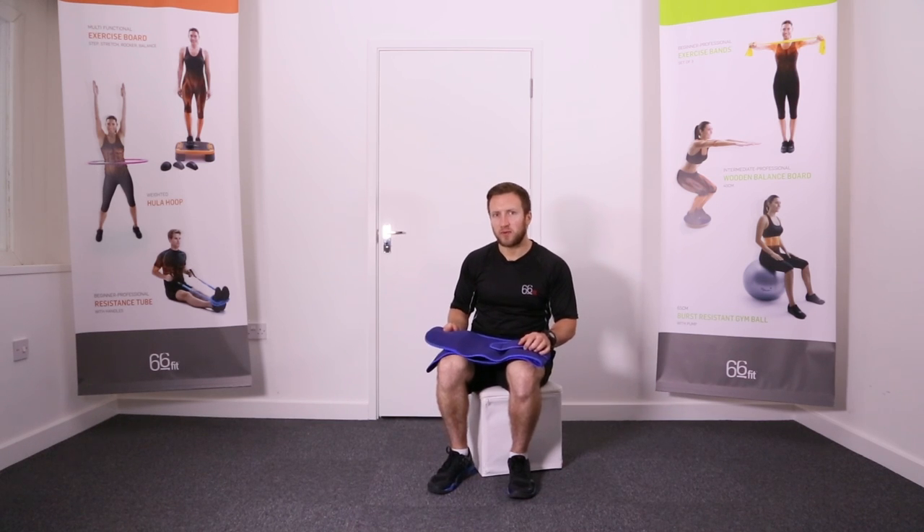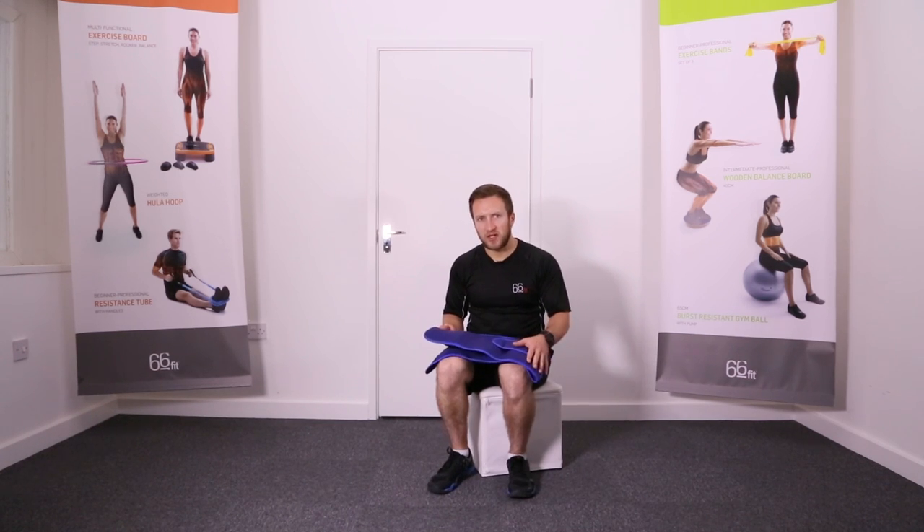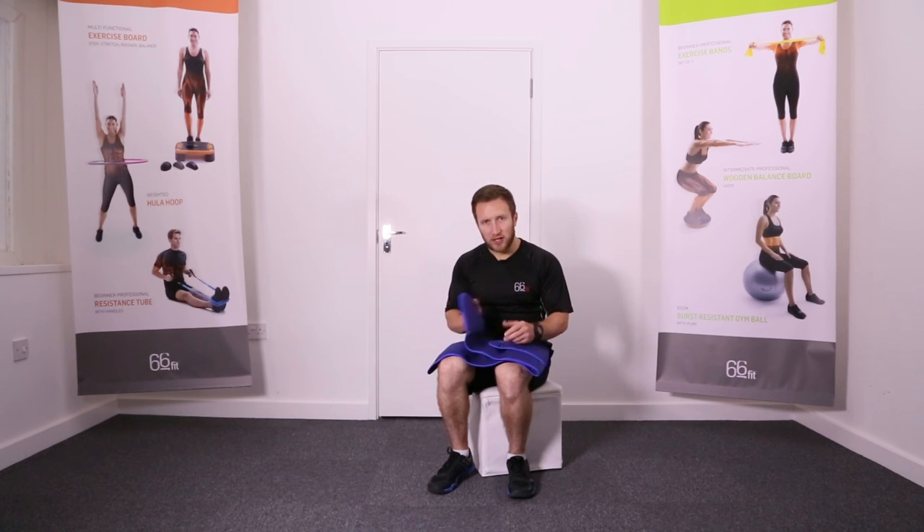This is the 66 Fit back brace with stays. This is a one-size-fits-all product, so you don't need to worry about buying small, medium, or large. The support itself is made of 100% neoprene on the inside and nylon on the outside.